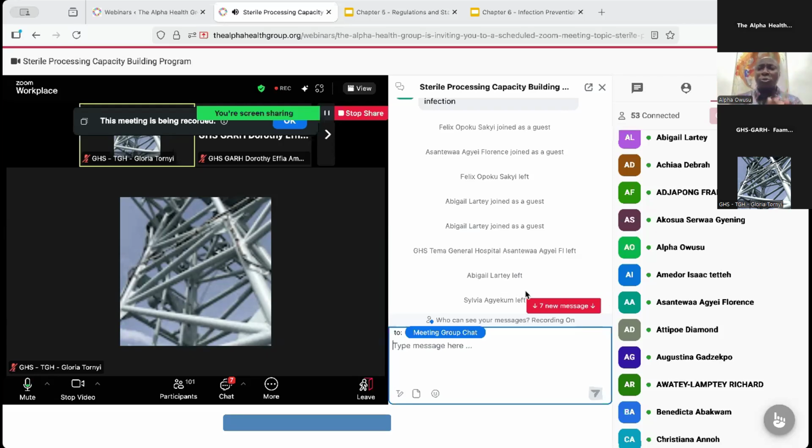And so by doing all these things, you are controlling infection, because the infection that went into the instrument when it was used on the patient or opened in the patient room has gone through a very stringent process: cleaning, handling, packaging, closing it through a sterile packaging, and then sterilizing, keeping sterility. By doing this consistently with standards, you are controlling infection.